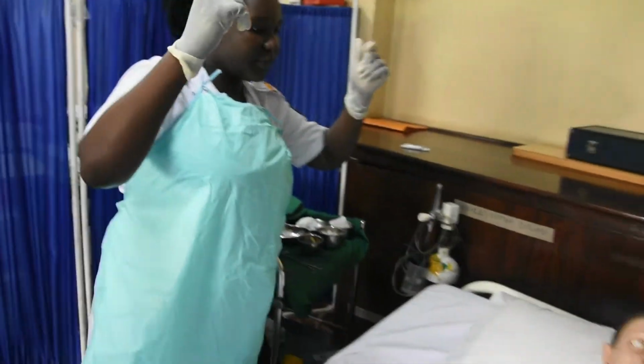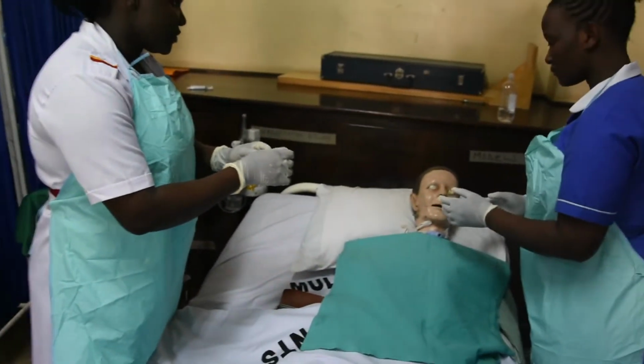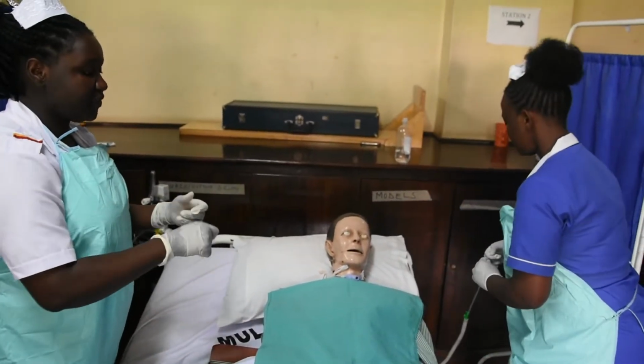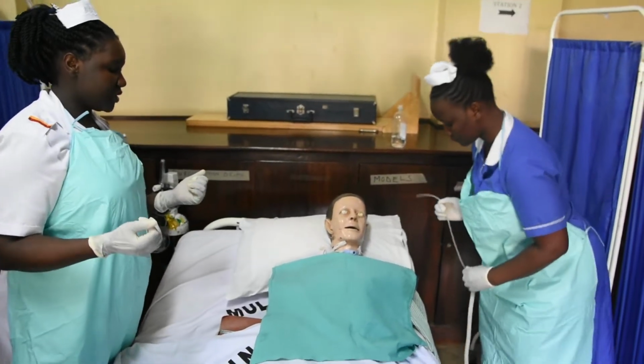So before we do anything, I request my assistant to help me suction the patient. We have to do suctioning before changing the tracheostomy tube and then after changing the tube.